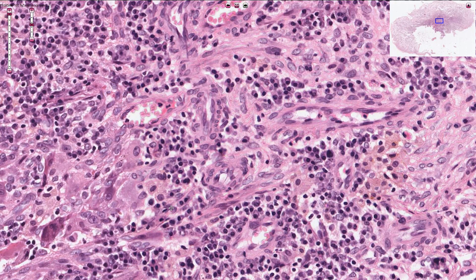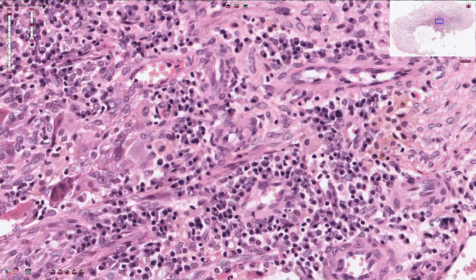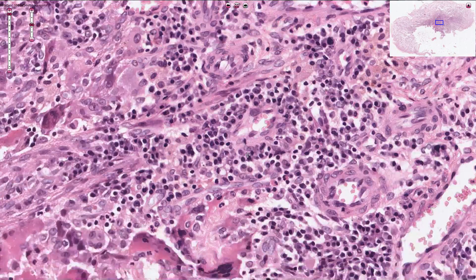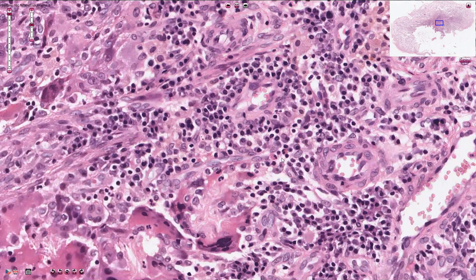Another type of inflammatory cell are granulocytes. Here we see two eosinophils with red granular cytoplasm and nuclei that have two lobes — they look like plums or sunglasses.